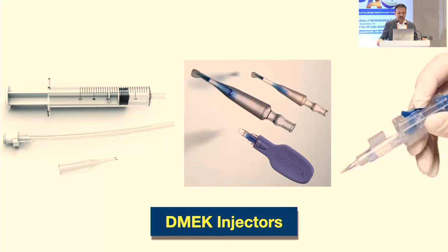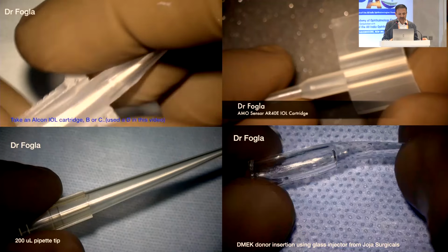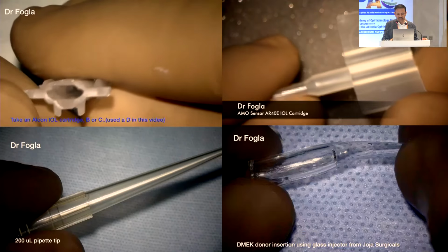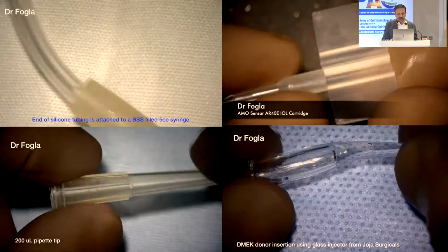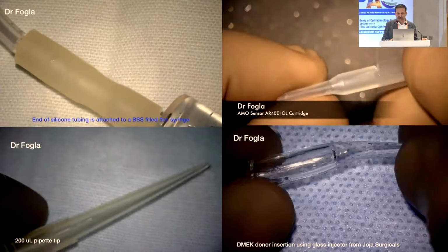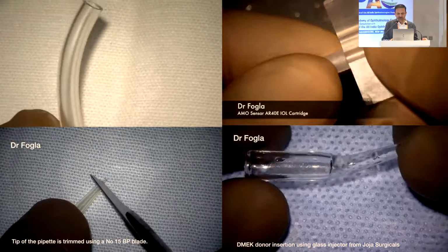To insert the donor, you basically need an injector. You can use a dedicated glass injector or an Endoglide, or you can even use an IOL cartridge to insert the donor DM scroll. Now, you can see that these are various donor delivery devices that can be created. You can use an Alcon cartridge or a Sensor cartridge or a micropipette or even a glass injector.